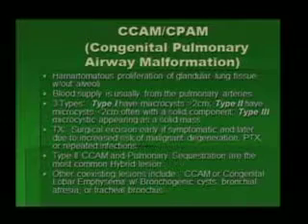Congenital lobar emphysema, why is it not congenital lobar emphysema? Because congenital lobar emphysema hates the lower lobes. It's left upper lobe greater than right middle lobe greater than right upper lobe. This is lower lobe. Cystic fibrosis: here are the vessels, I don't see any dilated bronchioles, no bronchiectasis. Pulmonary blastoma is a rare tumor. So the answer is CPAM.